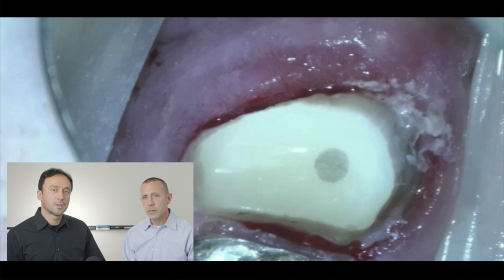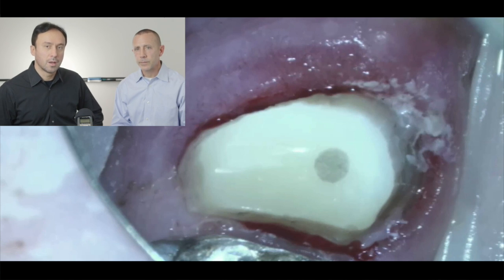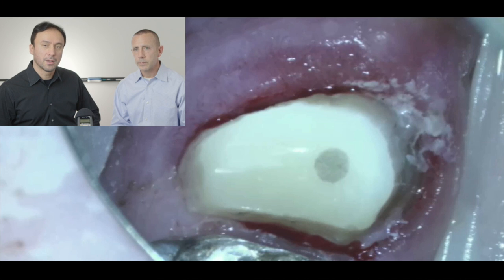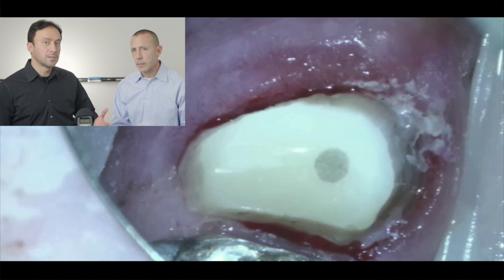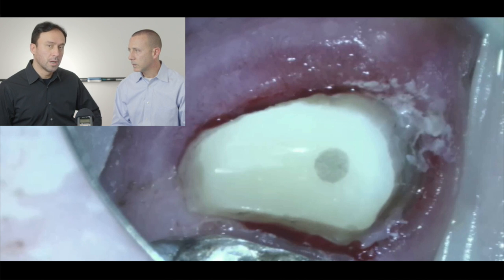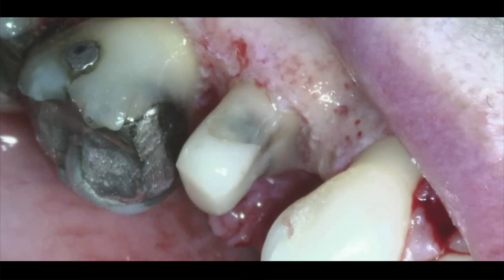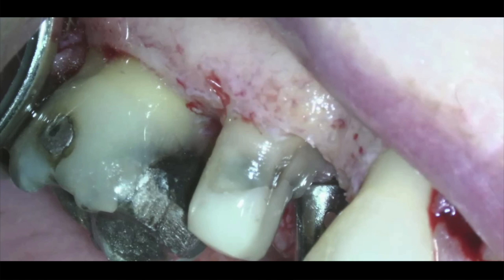We then proceeded to restore the tooth with a post and core using matching post and core materials. A prefabricated fiber post was bonded into place, then we proceeded to do crown lengthening. Since the tooth remained percussion-sensitive, we elected to do the apicoectomy at the same time — when going in surgically for crown lengthening, we didn't want to complete the crown and then have it fail apically. As you can see, there is a fairly good amount of ferrule around this tooth after the crown lengthening.